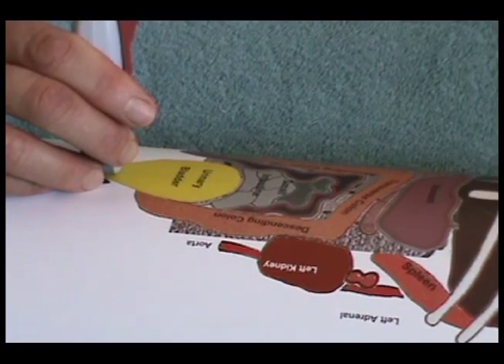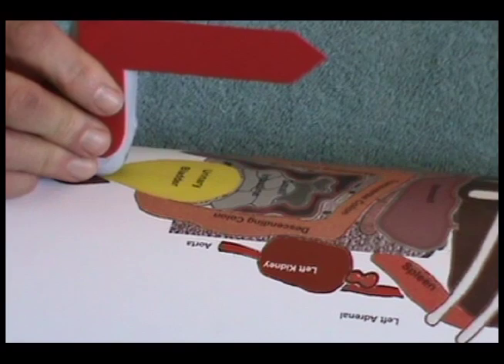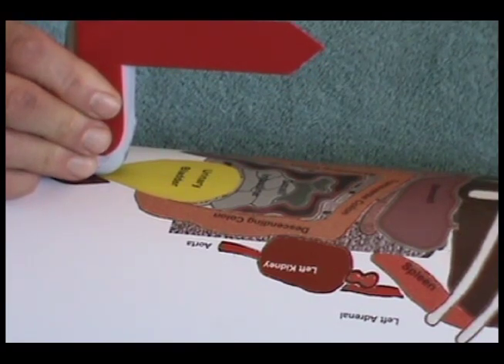At the caudal bladder, rotate the transducer 90 degrees clockwise back to a ventral midline sagittal position.